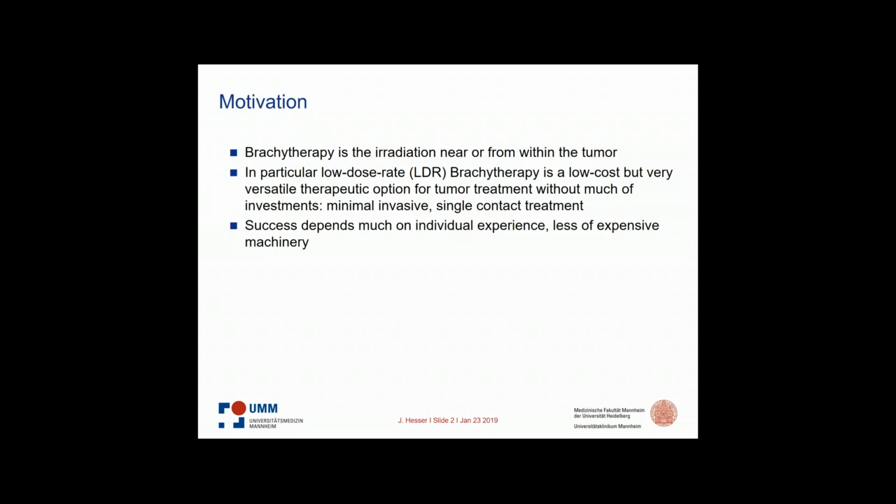It just needs a minimally invasive access, and then we have a single contact treatment. So the patients often just stay a day in a clinic and then leave. The success here depends on a lot of real experience and less on expensive machinery, like we know from teletherapy.